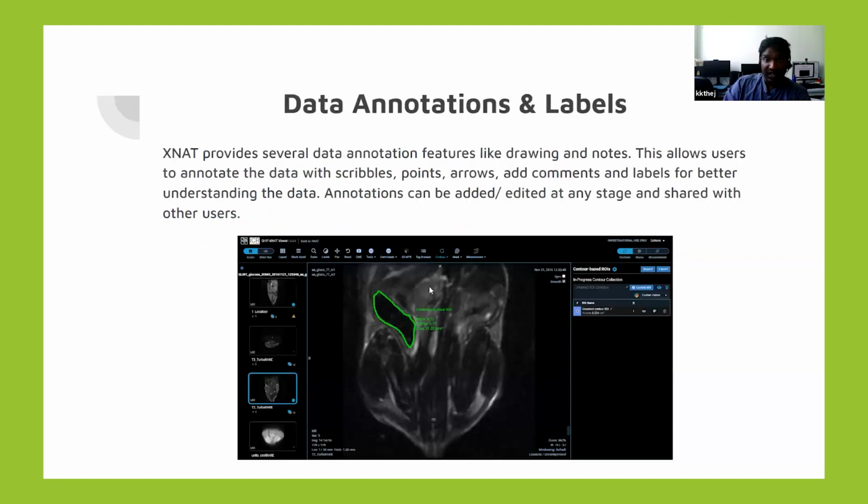Talking about data annotations and labels, which I mentioned a minute ago, it provides several data annotation features like drawing and making notes. This allows users to annotate the data with scribbles, points, arrows, all the options that you see. If you're familiar with any other medical image viewers, these options are pretty familiar to create the mask and measure. And the good thing is you can save it on your XNAT instance, and you can export all these masks and measurements and share them with your members or collaborators.